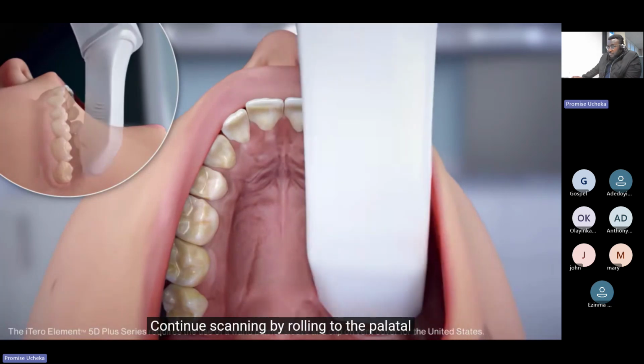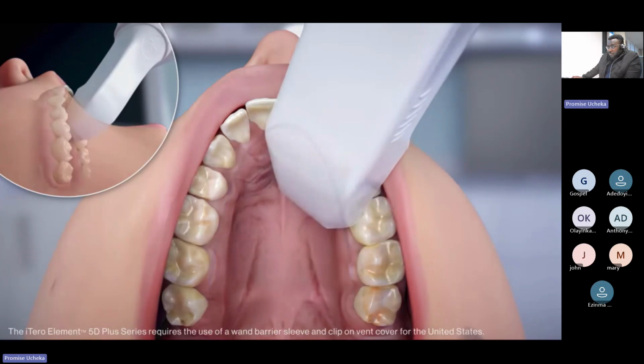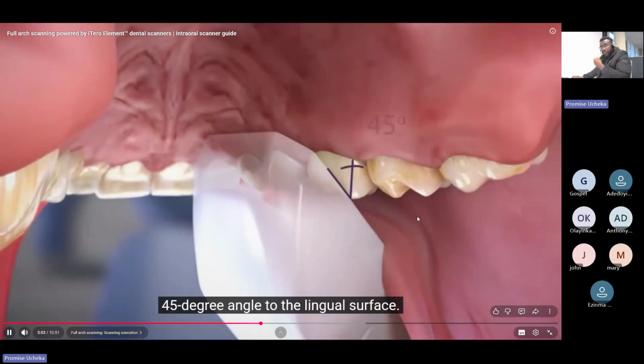Continue scanning by rolling to the palatal and capturing the palatal anatomy of the entire arch. Bring the cable end of the wand out to the side and maintain the wand tip at a vertical 45-degree angle to the lingual surface.